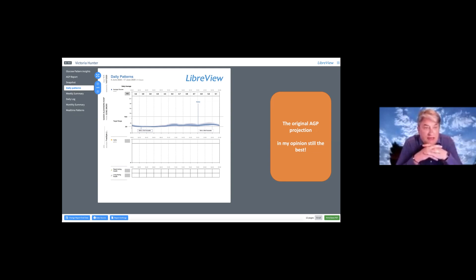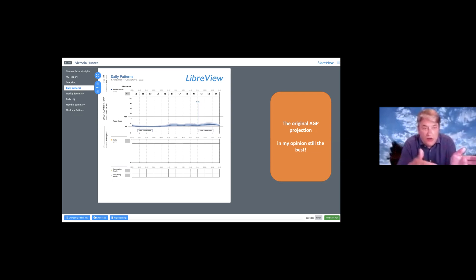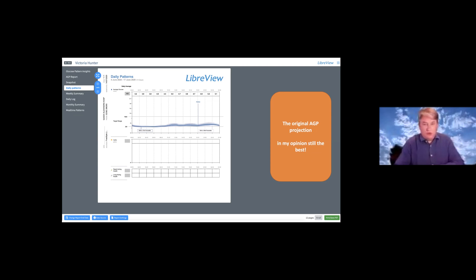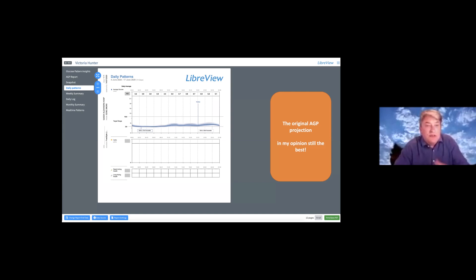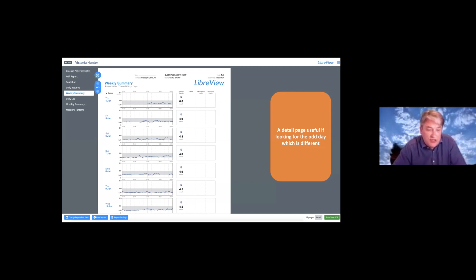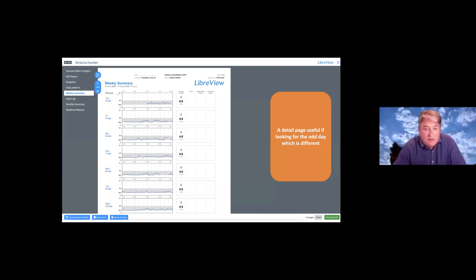The next one is the daily patterns view itself — the ambulatory glucose profile: the median, 25th and 75th percentiles, and the 90th and 10th percentiles over whatever time period you select. The standard is a two-week data collection period, which makes sense for most clinical applications, although very occasionally you might want to reassure yourself that things are running well over a longer period. The weekly view summary shows each day as an individual line; open dots on the line show the times the meter was scanned, while closed dots would be glucose data collected separately from finger strip testing.